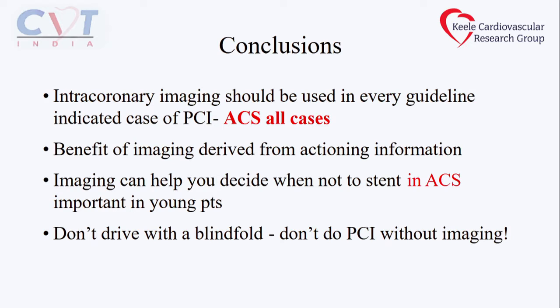I think the benefit of imaging is really derived from actioning information. Just putting an IVUS or an OCT catheter down a coronary artery doesn't magically change your prognosis. It's by doing something with the information that you find. I think importantly, in meetings such as this, the thing that we don't talk about is how imaging is useful to help you decide not to stent cases. That's a really, really important use of imaging.